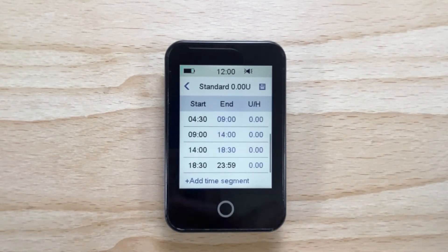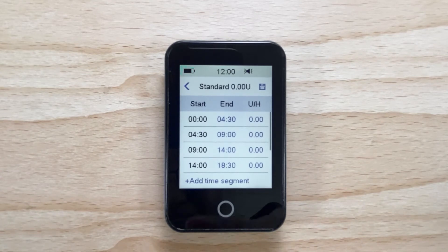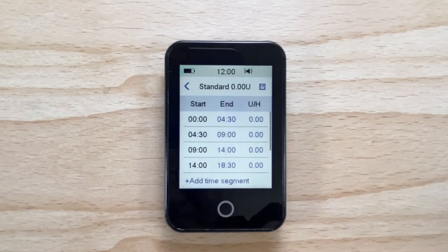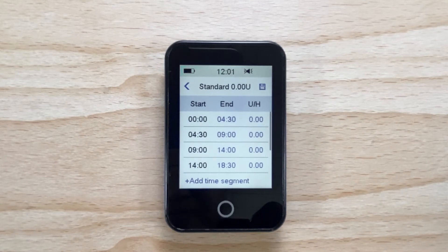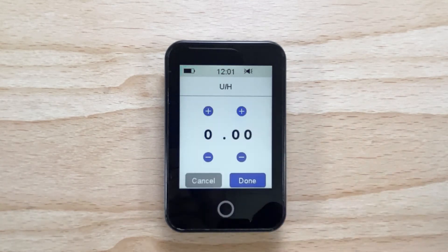You can scroll up and down by using your thumb or finger on the left hand side of the PDM to scroll through your different basal rates. You can adjust the insulin rate for each time segment by tapping on the blue numbers next to each time segment.